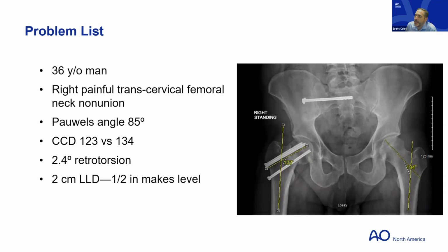10 to 15, depending on how we measure it, but it's 11. I mean, I get 11, so 10's fine. No, the horizontal plane discrepancy. 2.4 of retrotorsion versus 6 of antitorsion on the other side. So roughly 10. I think getting into increments smaller than 5 degrees with a sterile goniometer is nice conceptually, but it's measure with a micrometer, cut with an axe type concept.